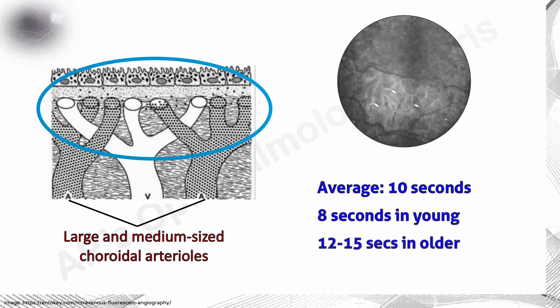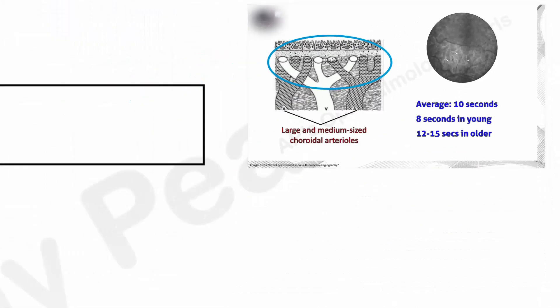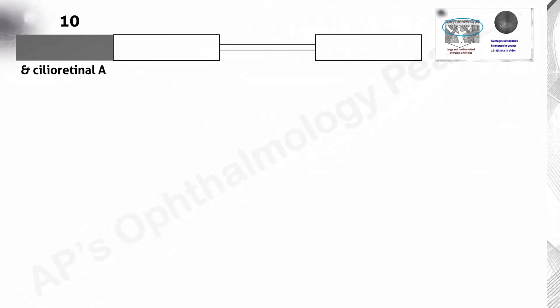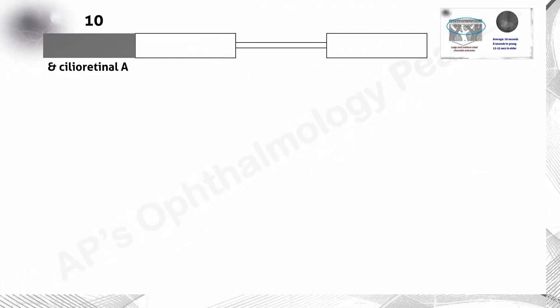Initial choroidal filling is patchy and mottled due to sequential filling of the choroidal lobules. Within 3 to 5 seconds, a uniform choroidal flush is seen. If there is a cilioretinal artery, it fills up at this stage.